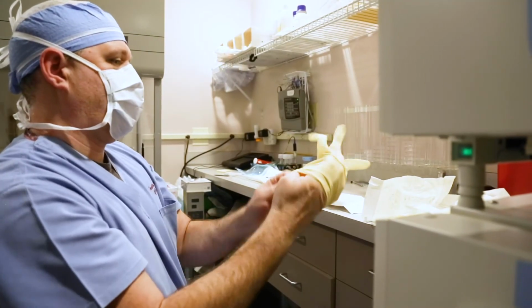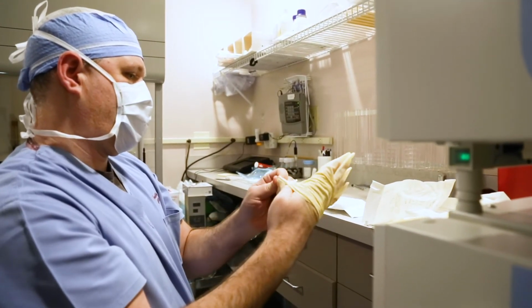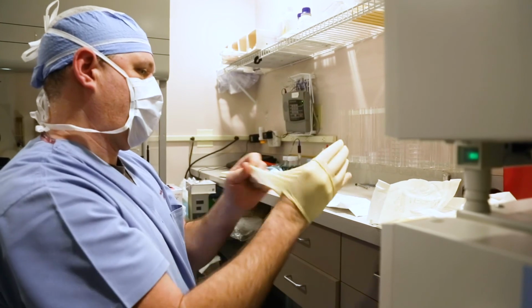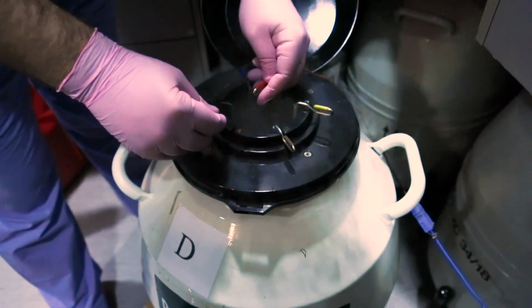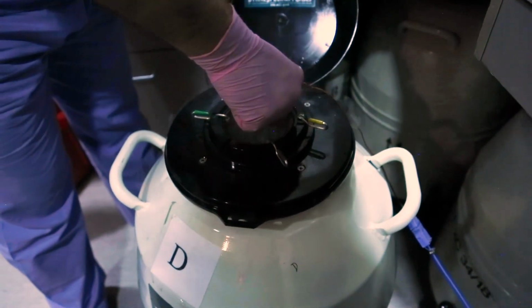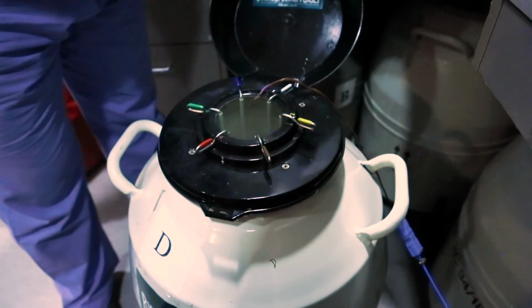I know that there's a lot of safety mechanisms in the laboratory. You know, you hear about national incidences where the wrong embryos are given to couples or maybe fertilization with the wrong sperm. How do you make sure that that does not occur in our laboratory? Everything we do in our laboratory is documented, signed by 2 people when sperm is being injected or placed into a dish for injection for that patient.